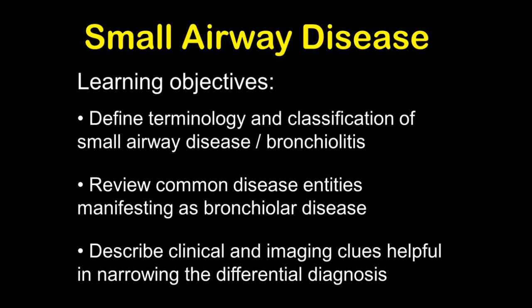The learning objectives of this lecture include define terminology and classification of small airway disease or bronchiolitis, review common disease entities manifesting as bronchiolar disease, and describe clinical and imaging clues helpful in narrowing the differential diagnosis.